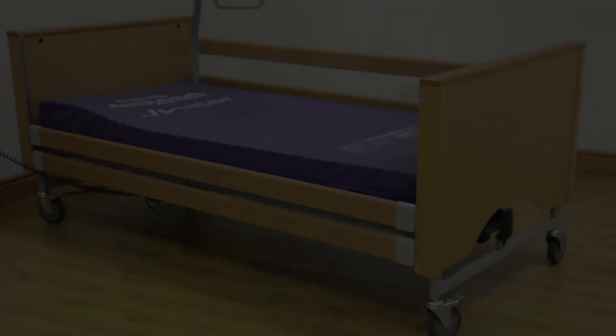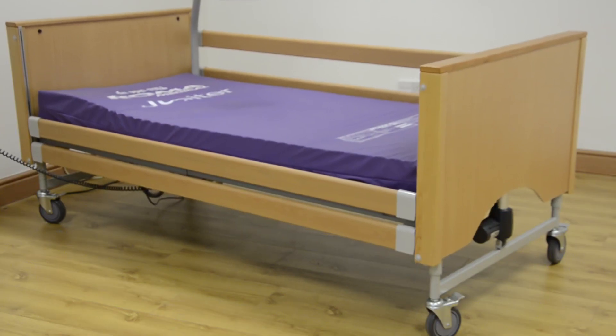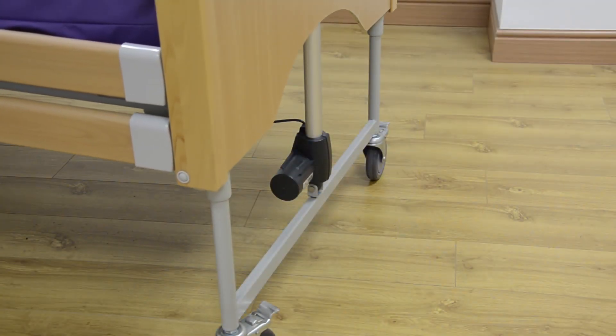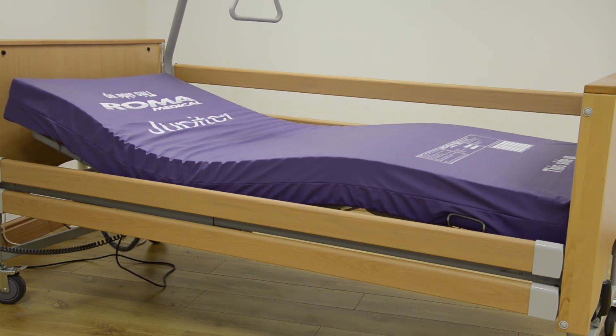The Siesta is a full profiling bed which is extremely robust with a heavy duty steel frame. The whole bed can raise and lower, allowing you to transfer in and out with ease. It's a fully adjustable bed with the top and bottom halves able to rise together or independently.